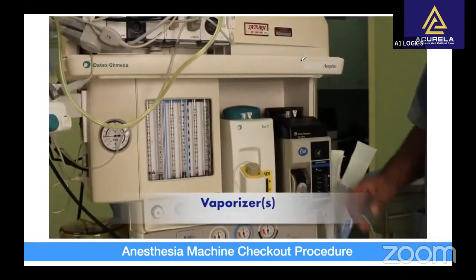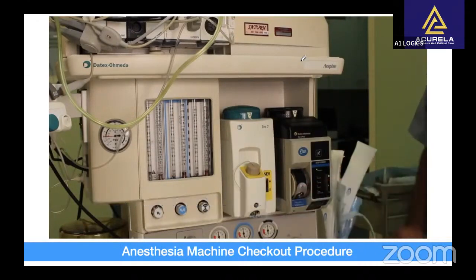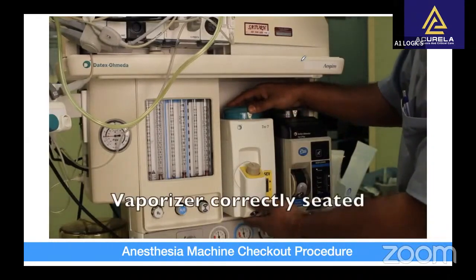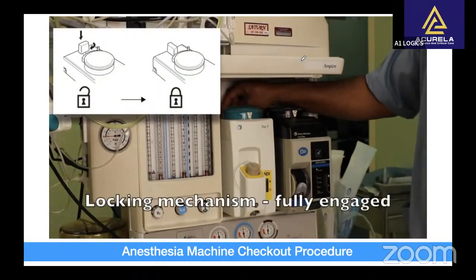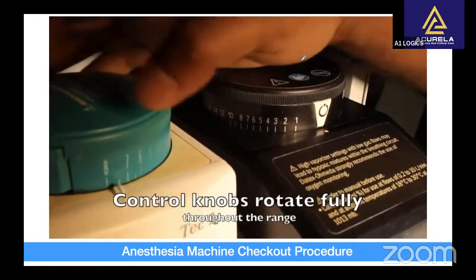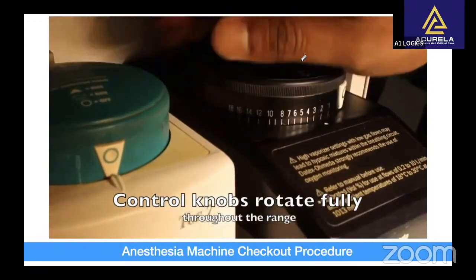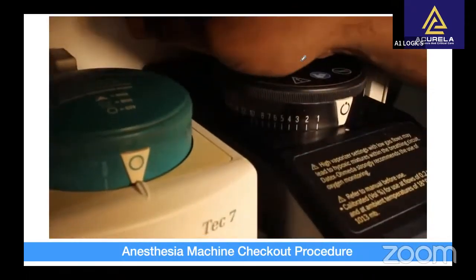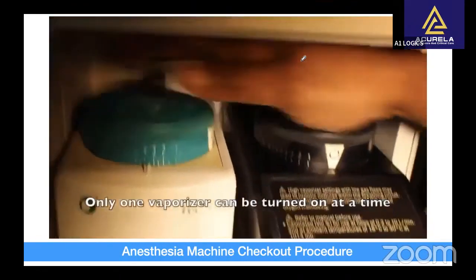Next, we'll check the vaporizers. Check that each vaporizer is adequately filled and not overfilled. Check that each vaporizer is correctly seated onto the back bar. See that the locking mechanism is fully engaged. The control knobs rotate fully throughout the range. Because of the locking mechanism, only one vaporizer can be turned on at any time.